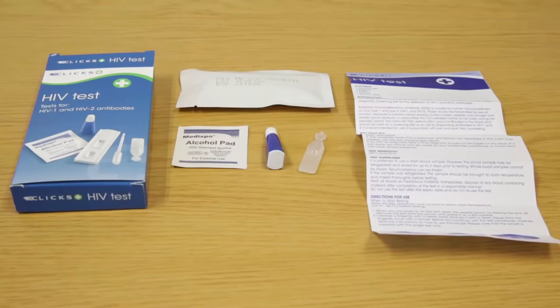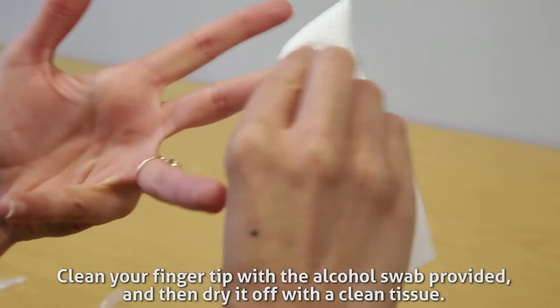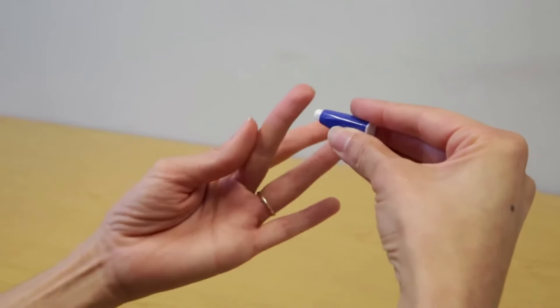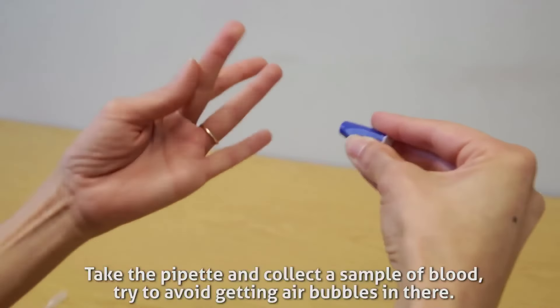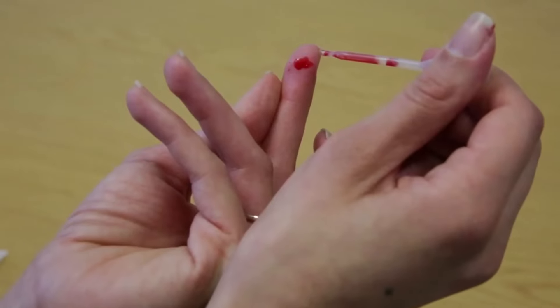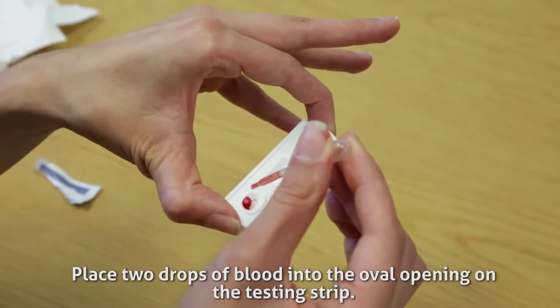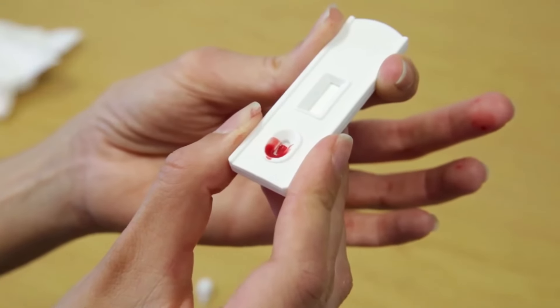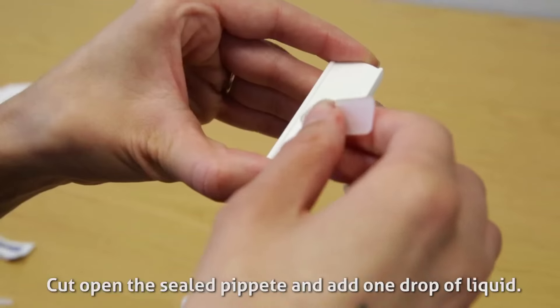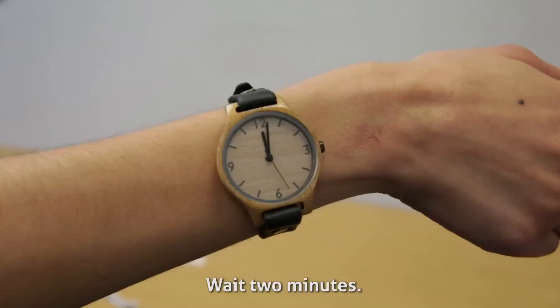Here's how HIV self-testing works. Clean your fingertip with the alcohol swab provided and then dry it off with a clean tissue. Take the pipette and collect a sample of blood, trying to avoid getting air bubbles. Place two drops of blood into the oval opening on the testing strip. Cut open the sealed pipette and add one drop of liquid. Wait two minutes.